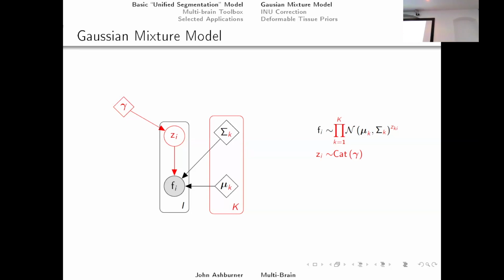We have these latent variables, which are basically: you take priors, which are the mixing proportions, and you've got a likelihood. You add the log prior and the log likelihood, run it through a softmax, and it gives you a belonging probability or a responsibility. Although in there, that's supposed to be categorical. So you've got an indicator variable indicating which Gaussian each voxel will be drawn from.